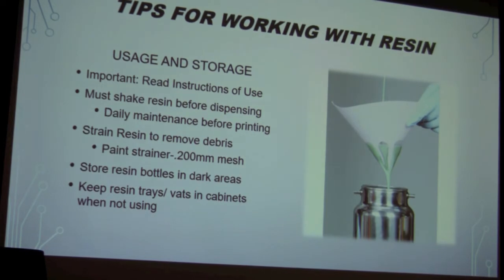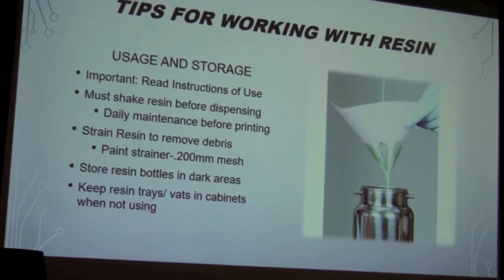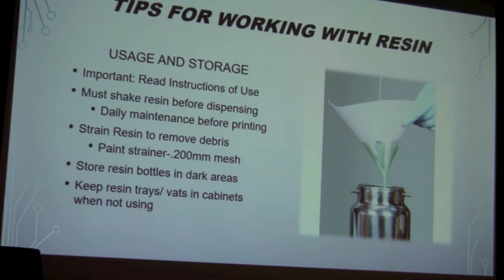The reason why you have to mix it in general is because there's pigments in it and they settle out. So this is just like the paint that you buy at Home Depot. You have to mix it before you can start using it. It's because the pigments settle out, the colors settle out.